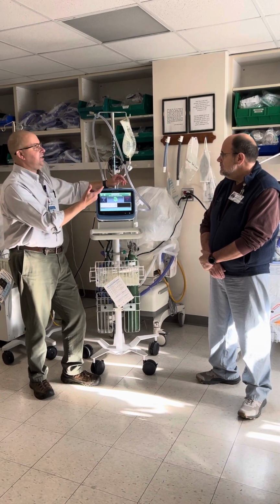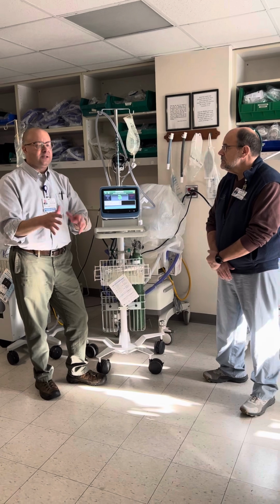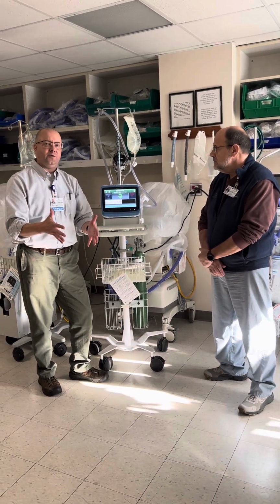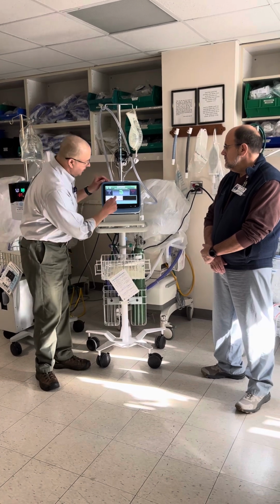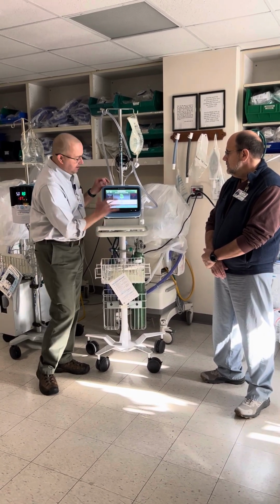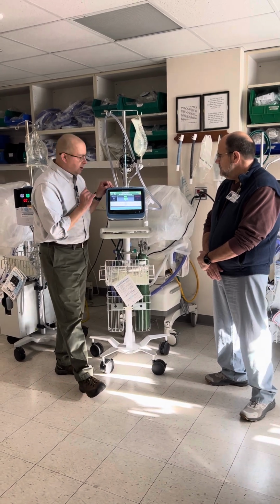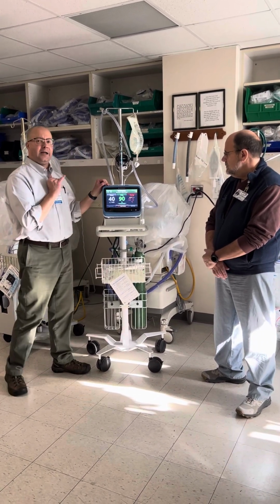Same parameters, Steve, like we talked about before. Yep. You've got your oxygen saturation parameters, let's say, for example, 88 to 92. You walk in to see Mr. Smith and he's satting 100. Drop it by 10%. Literally scroll across till you get to 90. There's a little blue button at the bottom called the confirm button. Confirm, and you're going to see that this says 90%.